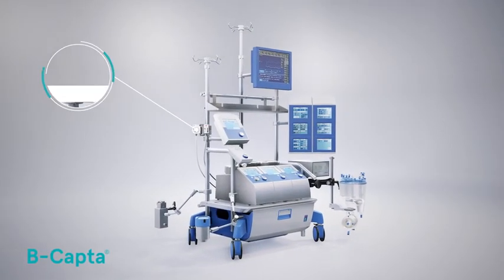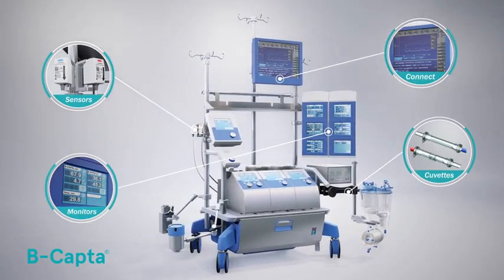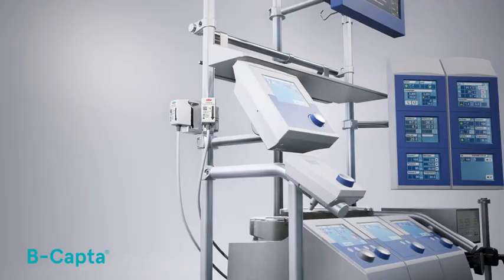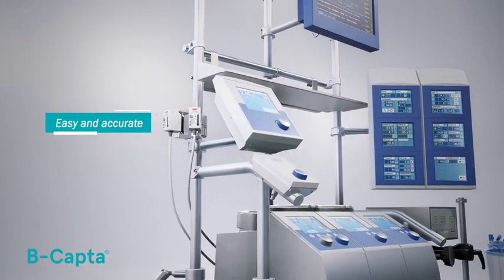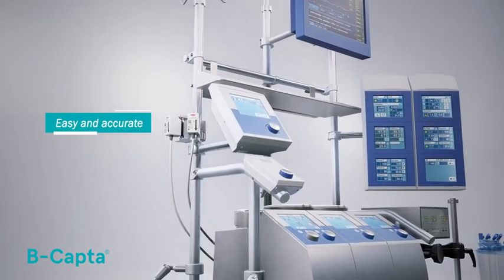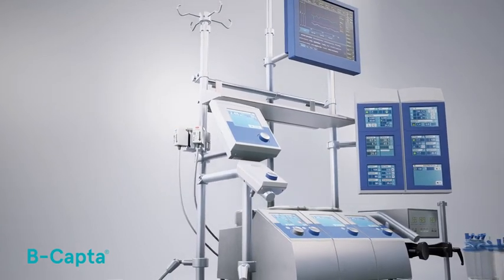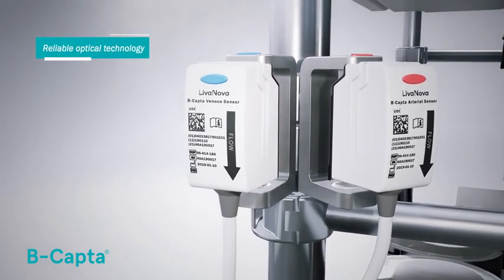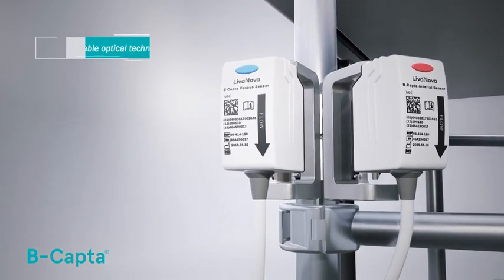B-Capta is the new, ready-to-go, in-line blood gas monitoring system integrated into the S5 heart-lung machine. It is designed to easily and accurately monitor arterial and venous blood gas parameters, even in long and complex cardiopulmonary bypass procedures. The system is based on reliable optical technology and provides only measured values to guarantee accurate monitoring.